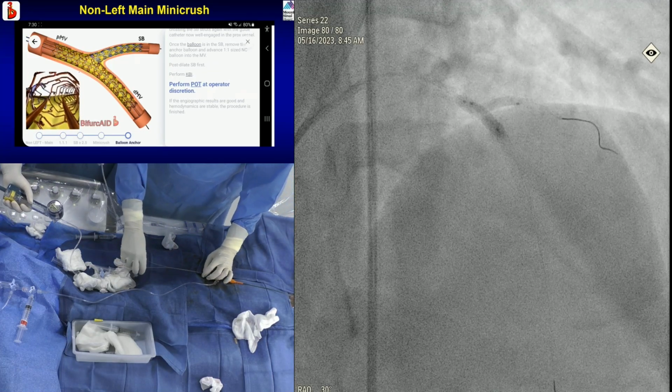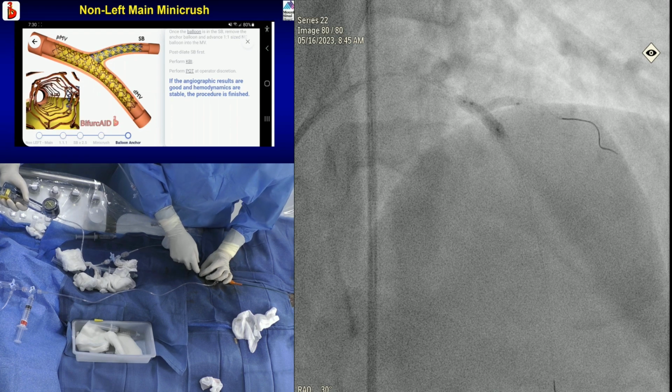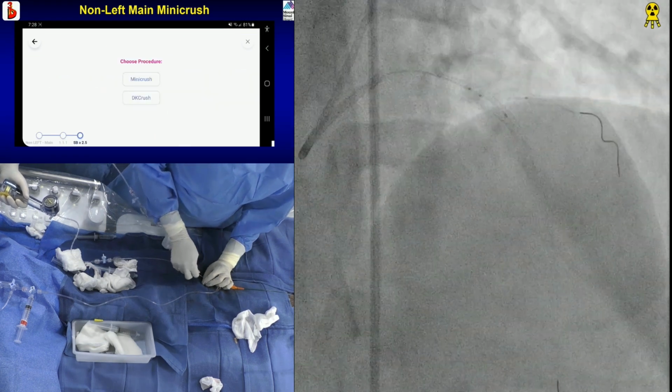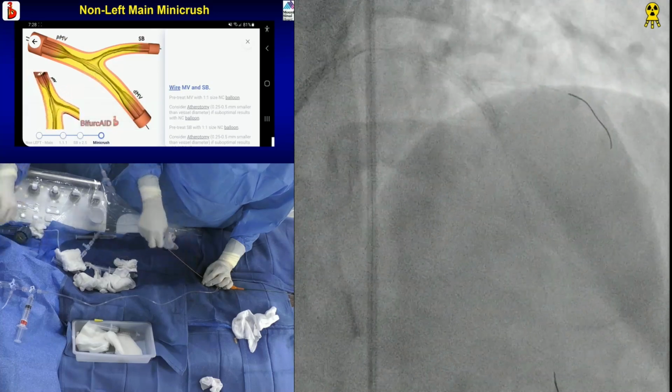Remember 3.5, did you open 2.5, 4.0? No, it's opened. Oh, it's open. Okay. But just show the picture so that I can go with my presentation. Okay. Come back in the guide, take a picture.